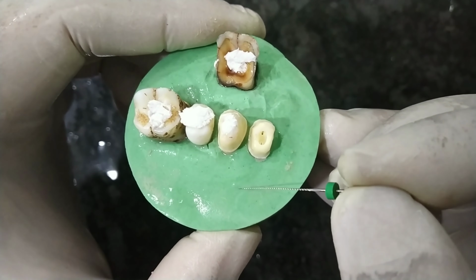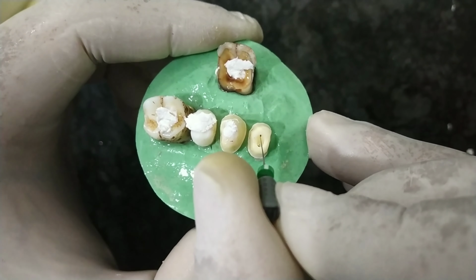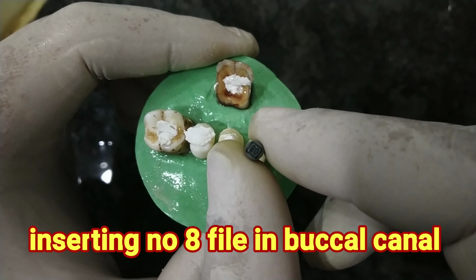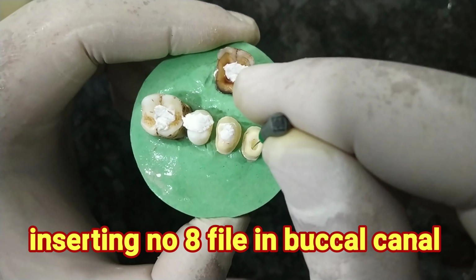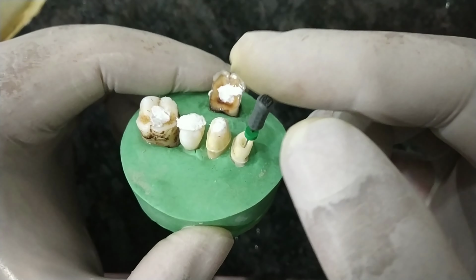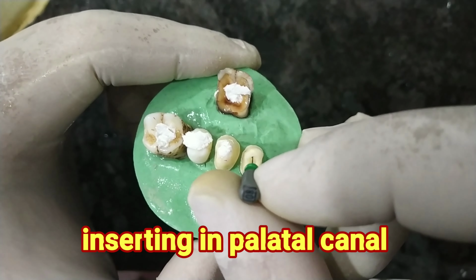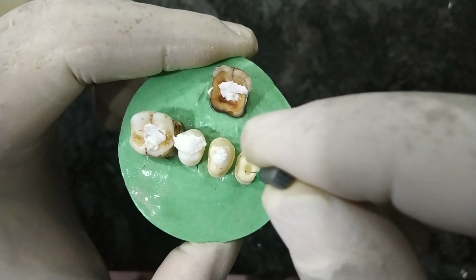So this is the buccal side, this is the palatal side. So I insert it here and it's going nicely in a watch winding motion. Number 8 file, you can see. Then again palatally you can see here. So I have got both the canals and you can see both the canals, buccal and palatal.